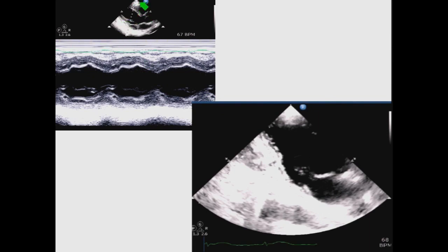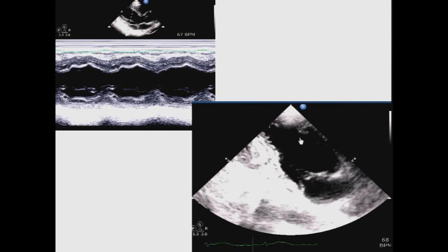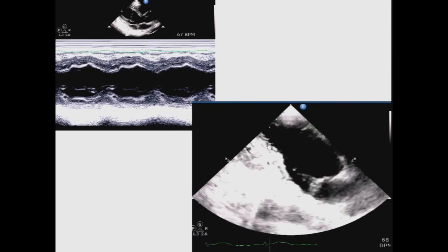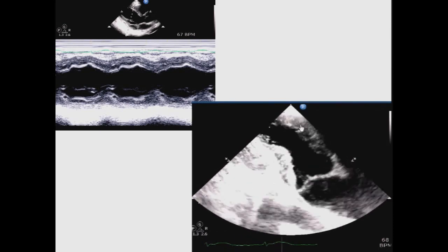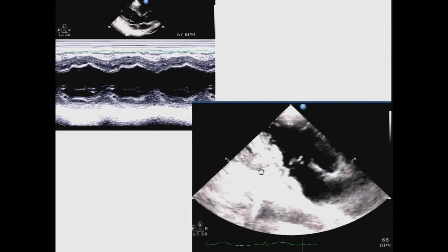You see the M-mode cursor through the left ventricle, and at the base of the heart you see nice symmetrical thickening of the walls. Unfortunately, this is a person where there is a distal left ventricular, distal septal and apical wall motion abnormality that the M-mode misses.